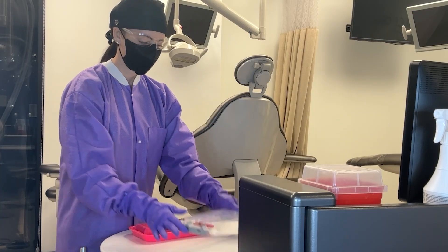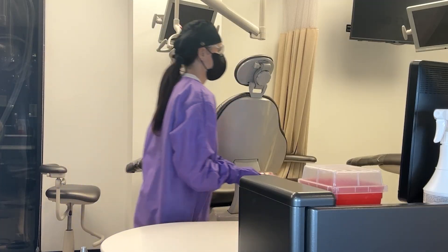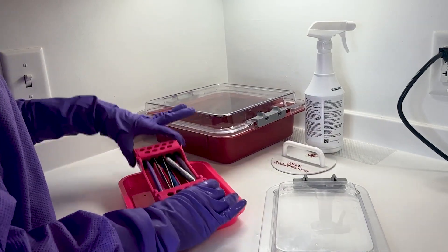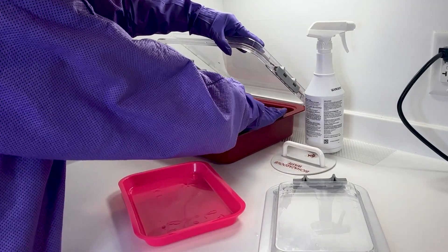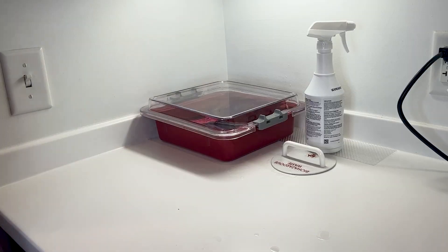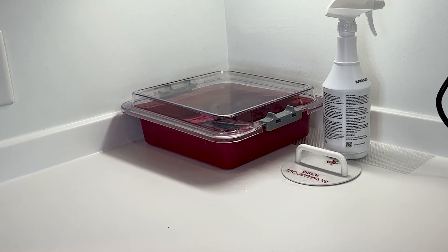Place the used instruments in a designated container for transportation to the decontamination area. This container should be leak-proof with labels of biohazard symbols, and in the decontamination area, you're going to immediately begin the process of removing gross debris and organic material.